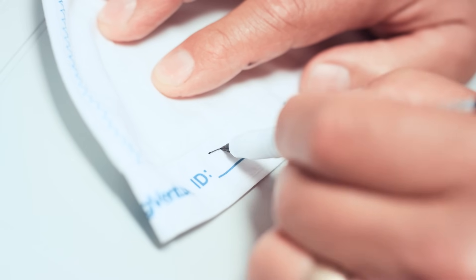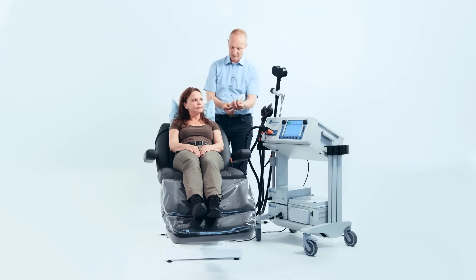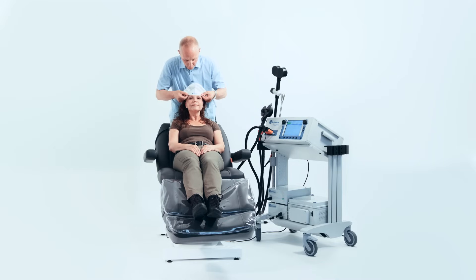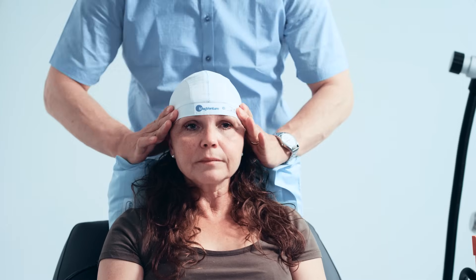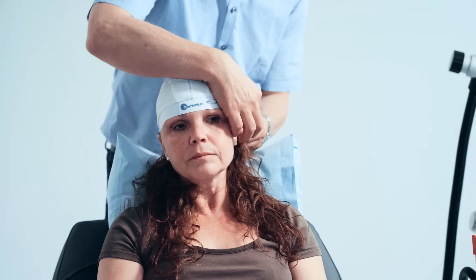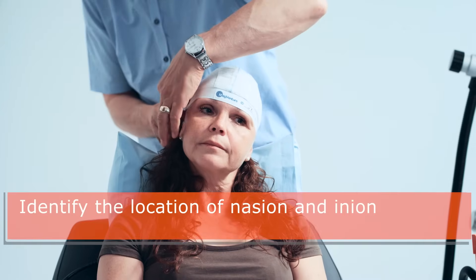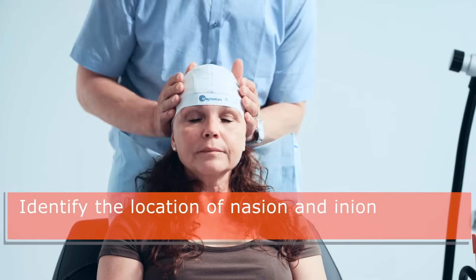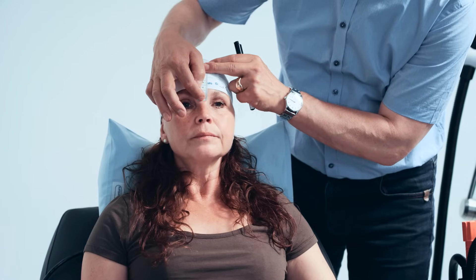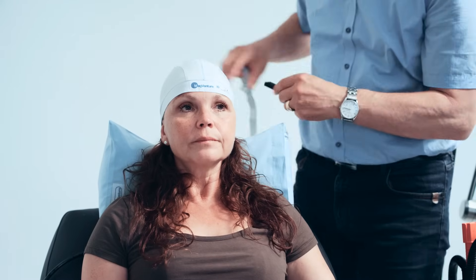To start, write the patient's ID on the cap and place it on the patient's head with the central seam aligned to the midline. Be sure the cap fits the patient's head snugly. To find the area of the scalp above the motor cortex, first identify the location of the nasion and inion. The nasion is the intersection of the frontal bone and two nasal bones of the skull — it is the deepest depression on the midline between the nose and forehead.